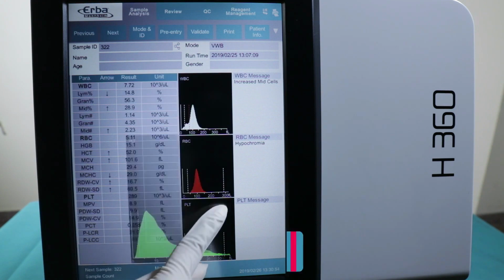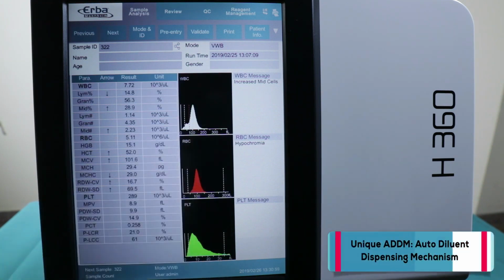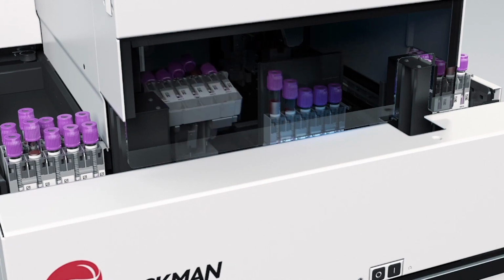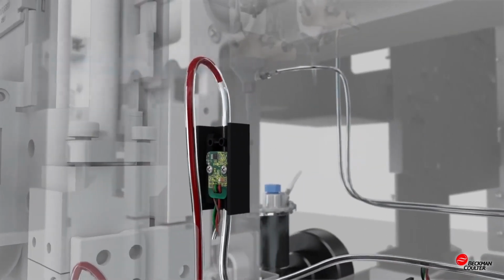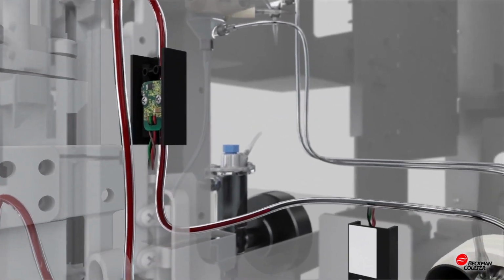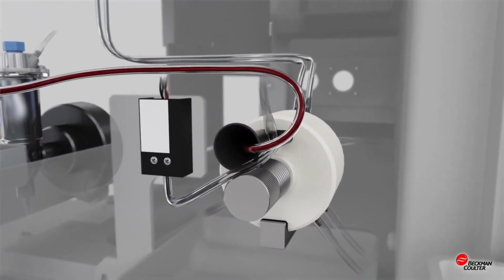The sample is lysed and dissolved into an electrolyte solution in a container, which also holds a smaller container. The smaller container has two pumps running to and from its solution, one creating a vacuum and the other replacing the lost solution. The smaller container has a small hole, an orifice, near the bottom of the container.